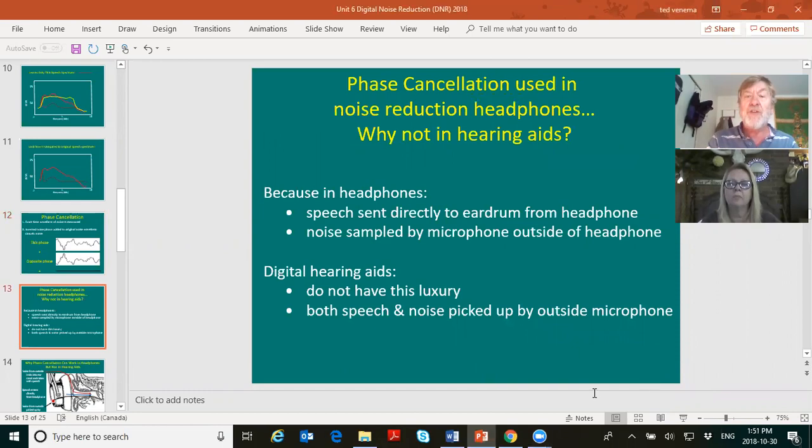So let's look a little closer at that. Because you know what, Angela? You are going to get clients coming in called engineers. They're the worst. Be afraid. Now don't. You know why? And they're going to ask you this. Well, I've got a set of Bose headphones. They're noise reduction headphones. I wear them on the plane all the time. They cut the background noise, no problem. How come your hearing aids can't do that?